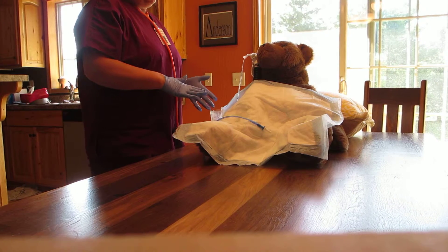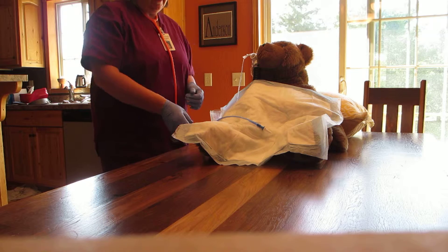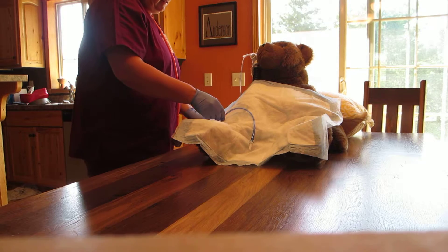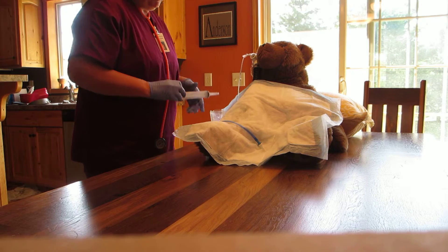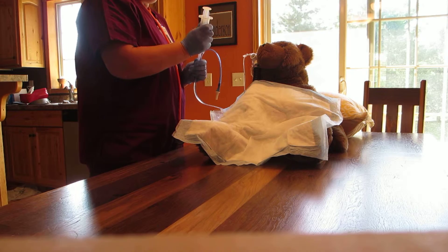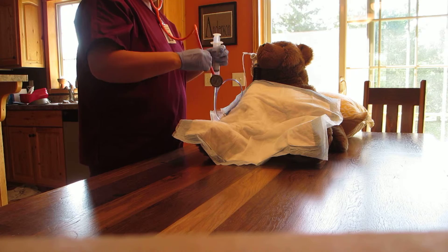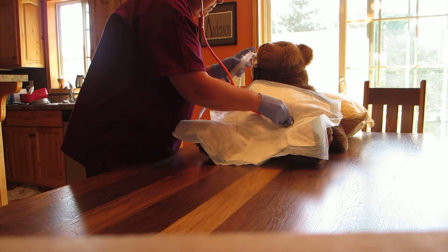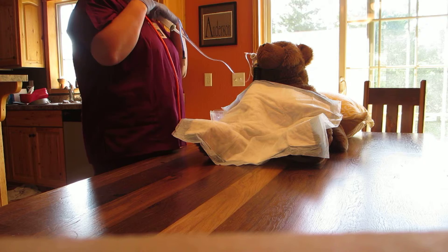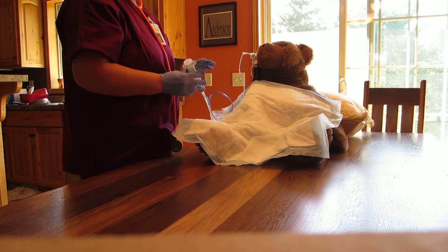I've come into my patient's room and I see that my patient's stomach is distended, so I assume there is some blockage going on. I'm going to remove my tubing from the suction and put five to ten cc's of air into my tubing and listen to the fundus of the stomach for a swish sound. I don't hear anything, so I'm also going to try to aspirate some fluid from my patient's stomach — and nothing is coming back, so I assume there is a blockage.